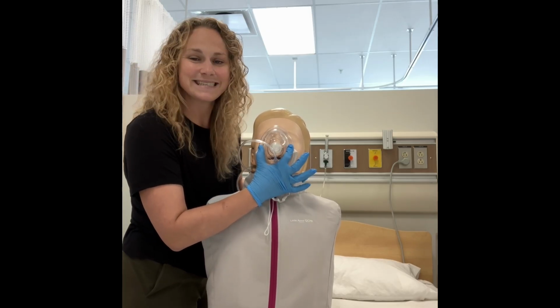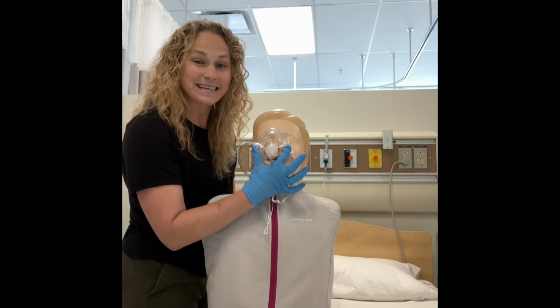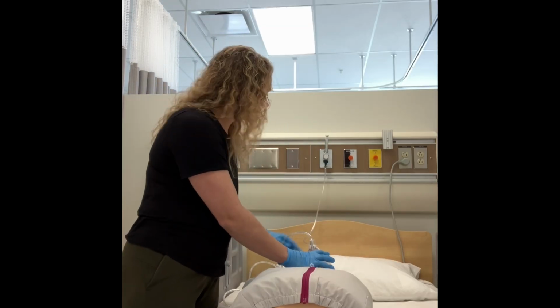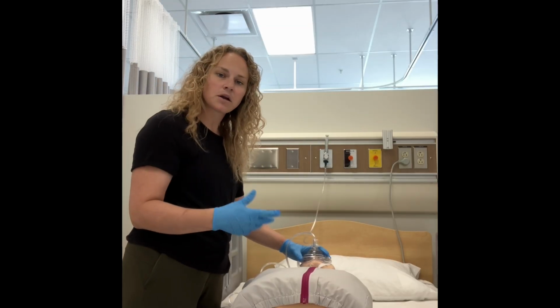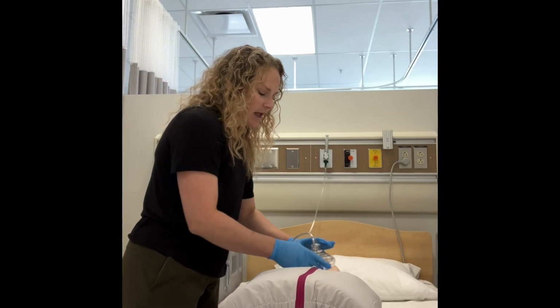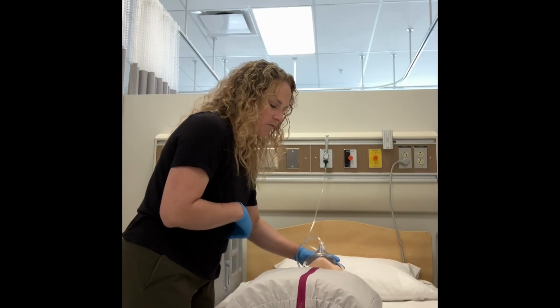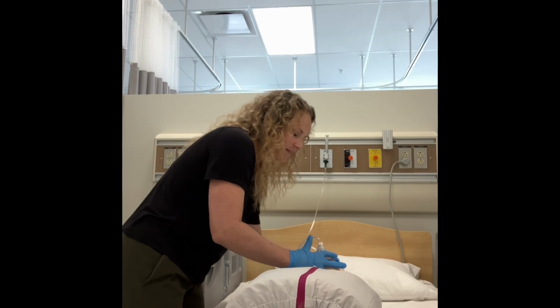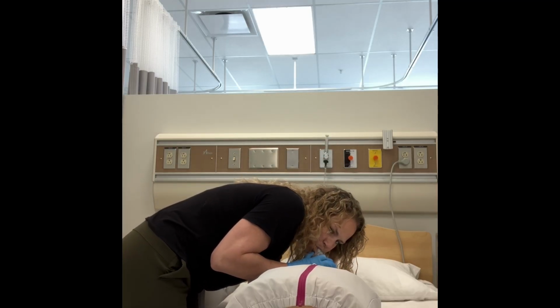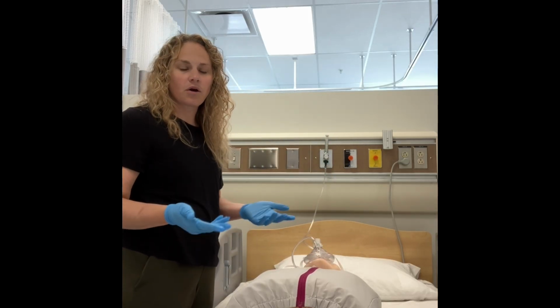Importantly, this has to seal down. So if it is too low or too high and it can't seal on the face, the breaths will not go in. I connect this via my tubing to my flow meter, which is set at, again, 6 to 10 liters per minute. And then I can use that to assist in my breathing. So I will perform a head tilt chin lift, maintain that seal, and then breathe into my patient while delivering CPR or artificial respiration.